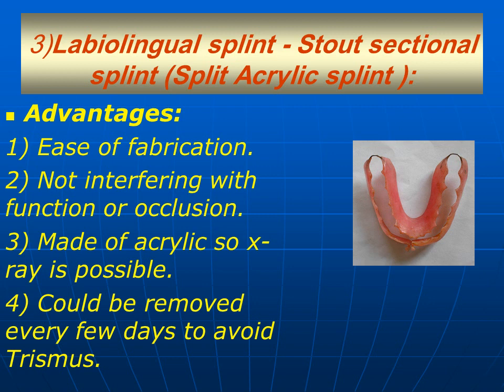Advantages: ease of fabrication, not interfering with the function or occlusion, made of acrylic resin so X-ray is possible to ensure the healing of the fracture, could be removed every few days to avoid trismus.